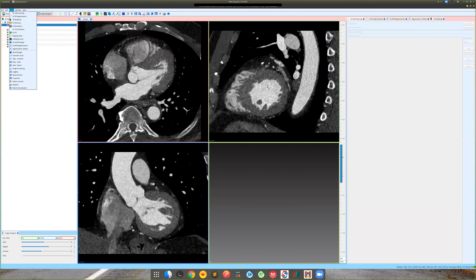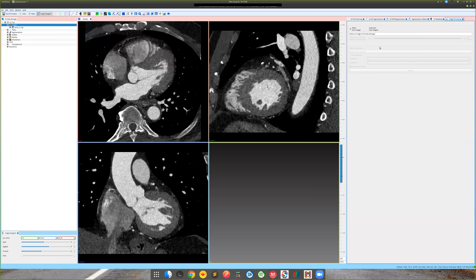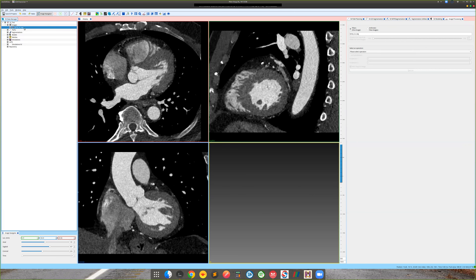The first step before proceeding to 3D segmentation is to filter this noise. SimVascular has some nice tools — go to the Tools menu and there's an option called Image Processing. These operations are outside of the regular SimVascular workflow, so images generated by processing the original are not saved as part of the SimVascular workflow. You need to save them explicitly.